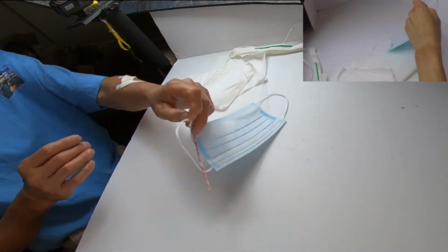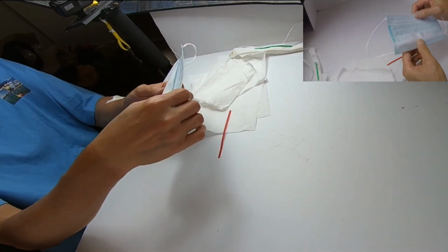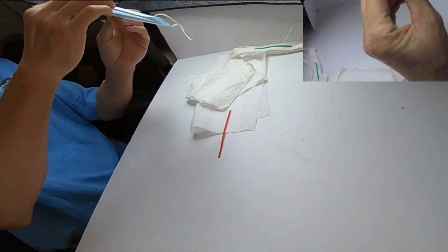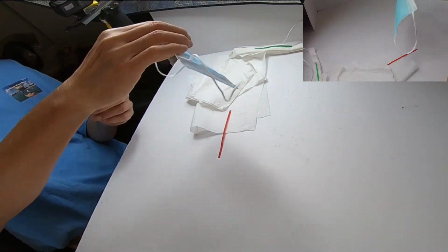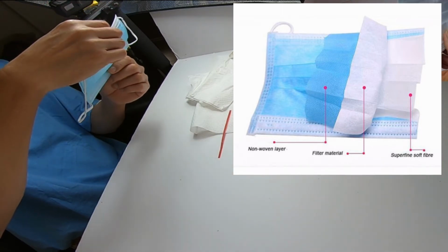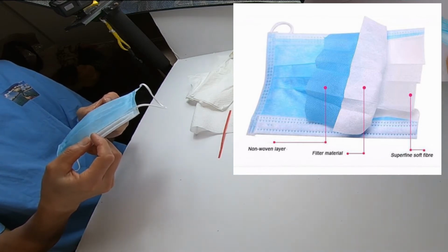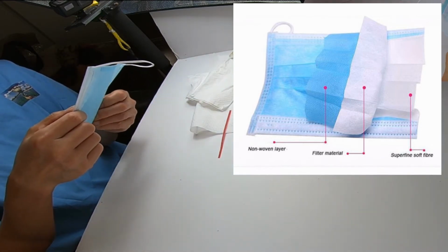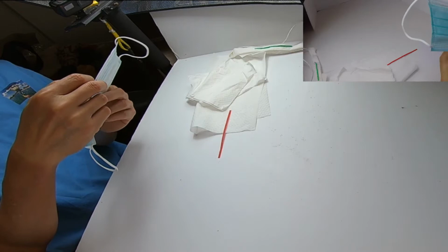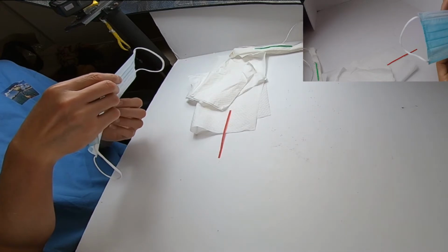So as I continue with the video, what we see here is a standard surgical mask. It has 3 layers and it's fairly thin. I guess you get an idea about how thin it is. It shines, you can see right through the material, and it's just not of much substance. In fact, you can almost see that the outer layer is translucent, as is the inner layer, and the layer in between is not all that thick. So the actual filtering from this mask is, while still pretty good, quite minimal.